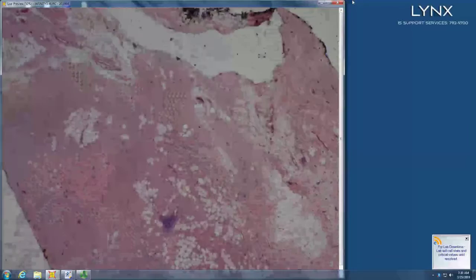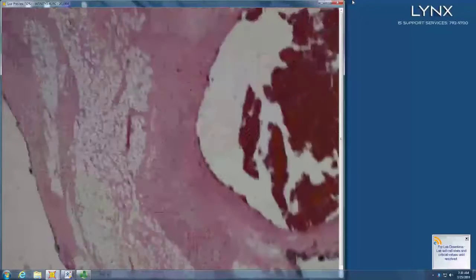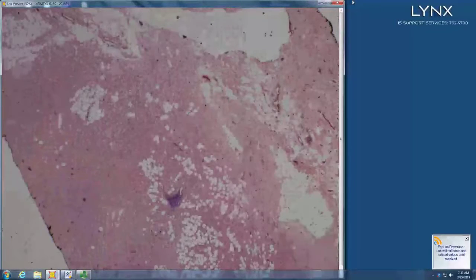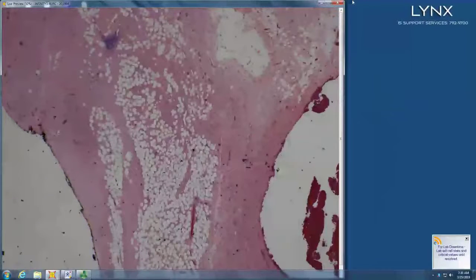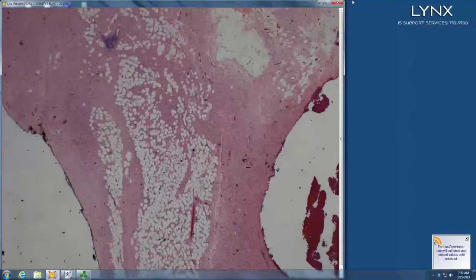Soft tissue thing. Honeycomb infiltrate in the subcutis. DFSP, or diffuse NF, and that's your differential, right? And this is from a von Recklinghausen's patient, and was diffuse NF, but they really look similar, right? Myxoid DFSP and diffuse NF can be dead ringers. Myxoid DFSP tends to lose its CD34 staining.